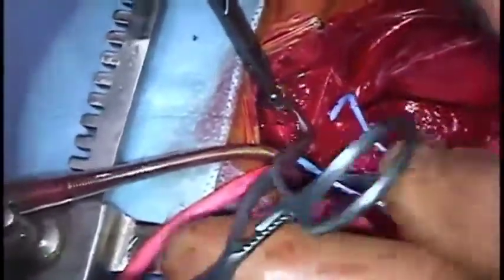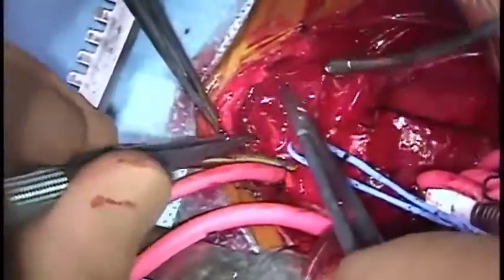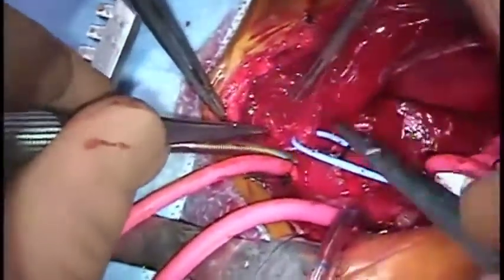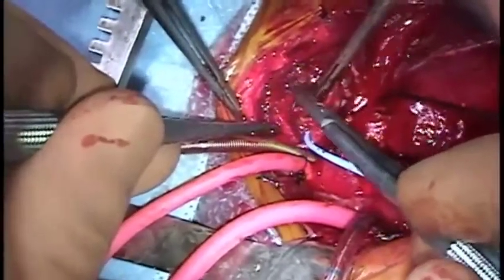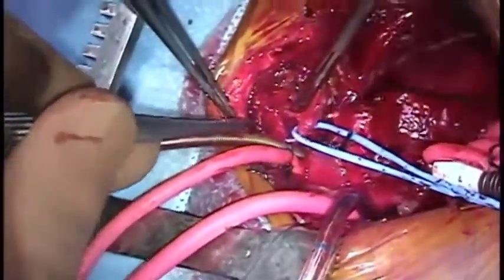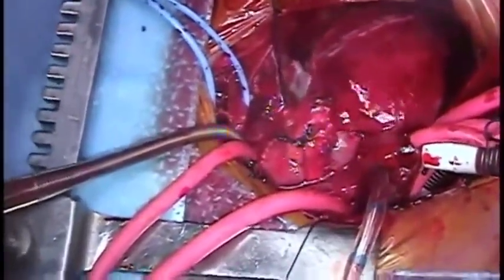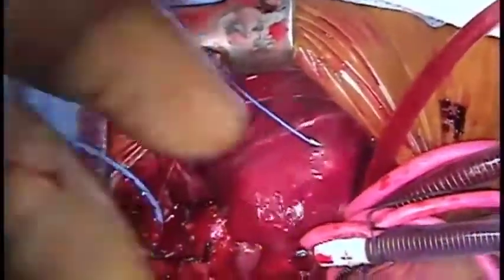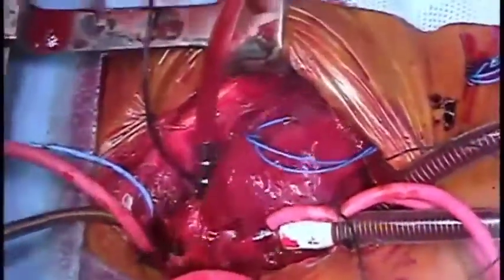Clamps are released to fill the anastomosis with blood in order to prevent the final stitches picking up the back wall of the anastomosis. Two right ventricular temporary pacing wires were applied during rewarming. The sternal retractor is relaxed to reduce the stretch on the pulmonary arteries.